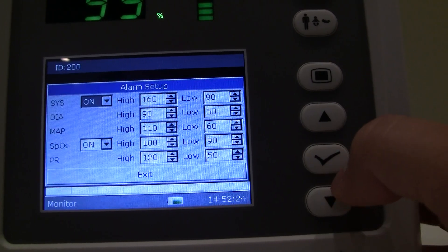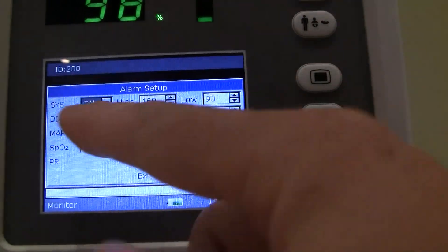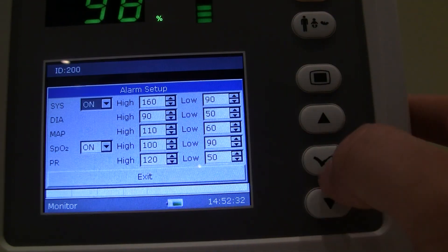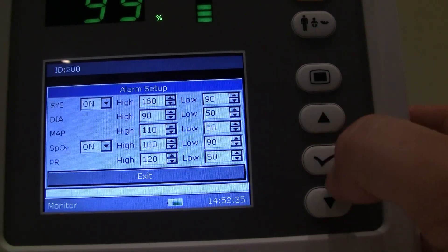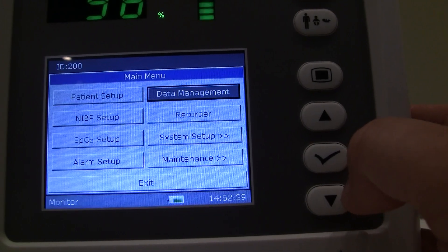Alarm setup is where you set all your high and low alarms. You can set systolic high/low, diastolic high/low, mean arterial pressure, and so on. Configure that however you want, and if your patient's vitals change above or below those parameters that you dictate, it will sound the alarm.